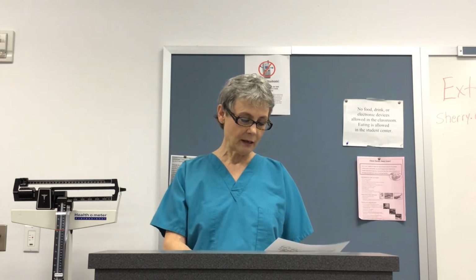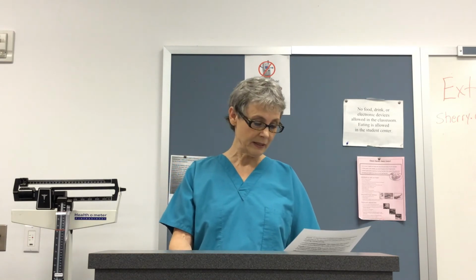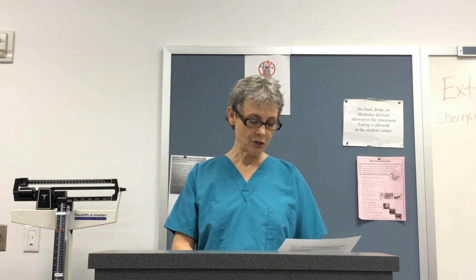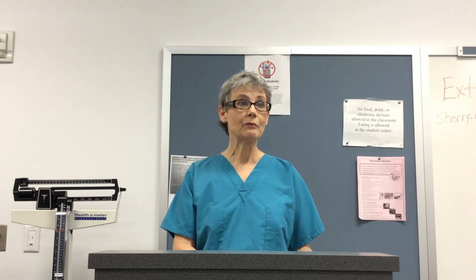IV push is usually given over 1 to 3 minutes. We talked about that. And we also talked about IV piggybacks. I showed you the smaller bag being mixed with your medication, and it runs intermittently.